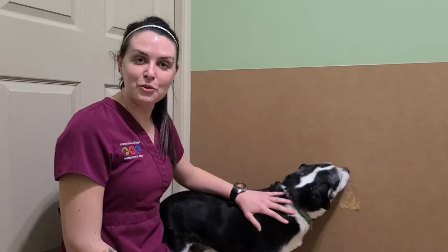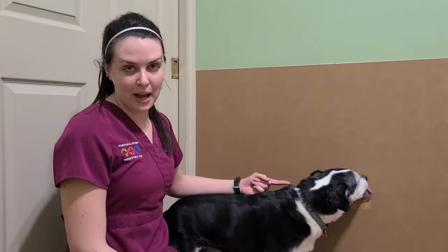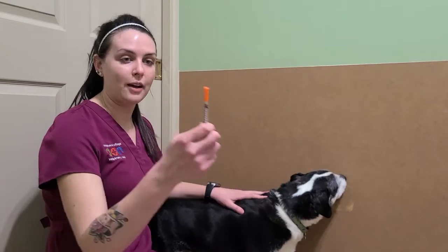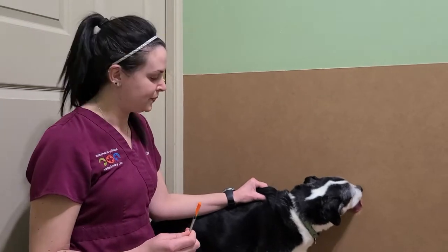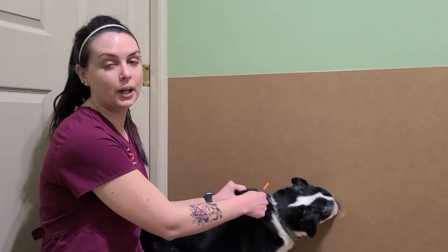Now you guys all know Ruger — he's going to be my little guinea pig today. I'm using a fear-free method; he loves peanut butter, and so to keep him distracted from his injection, I gave him a little treat. Now we have our five unit injection. What I'm going to do is grab his shoulder blades right here and pull up on his skin. When you feel here, there's a little tent — as I call it — where there's space where you can put an easy injection.